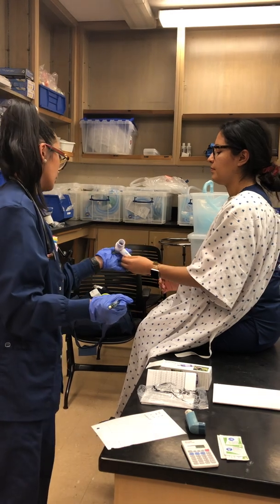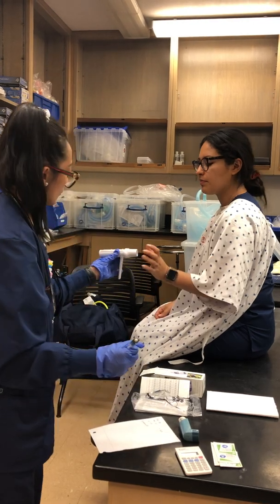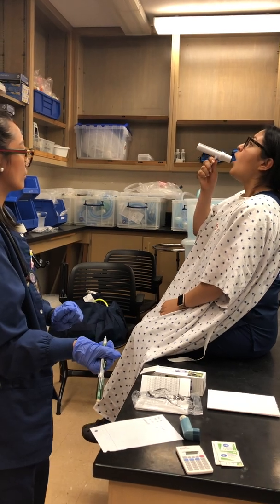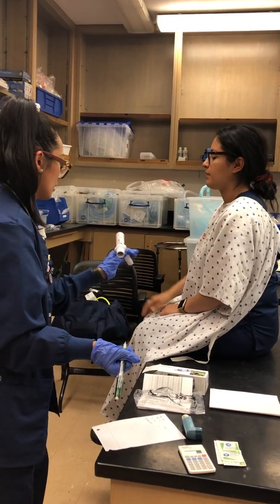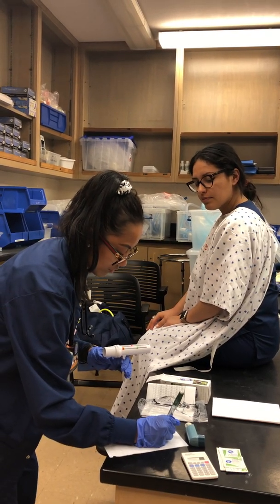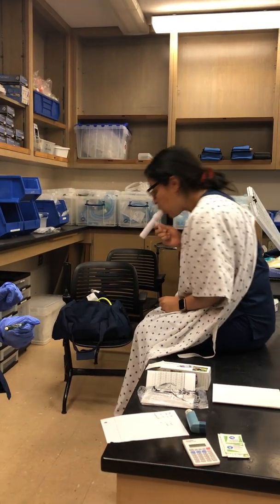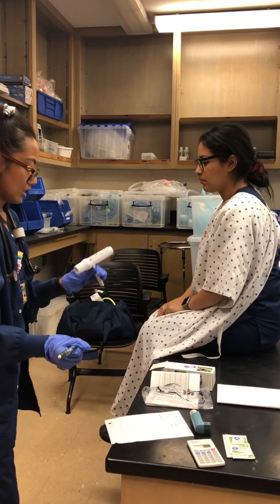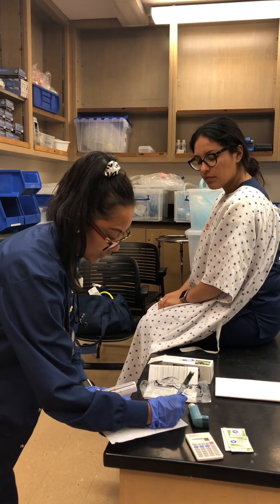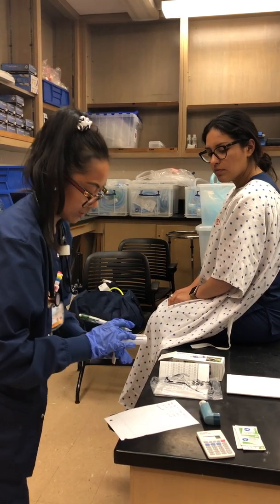Okay, so for this one we got 250. Okay, 2 more actually, whenever you're ready. Got 255 again, and then your last try. There you go. Okay, and we got 255 again. Okay, and your goal was 390. And then reset this for next time.